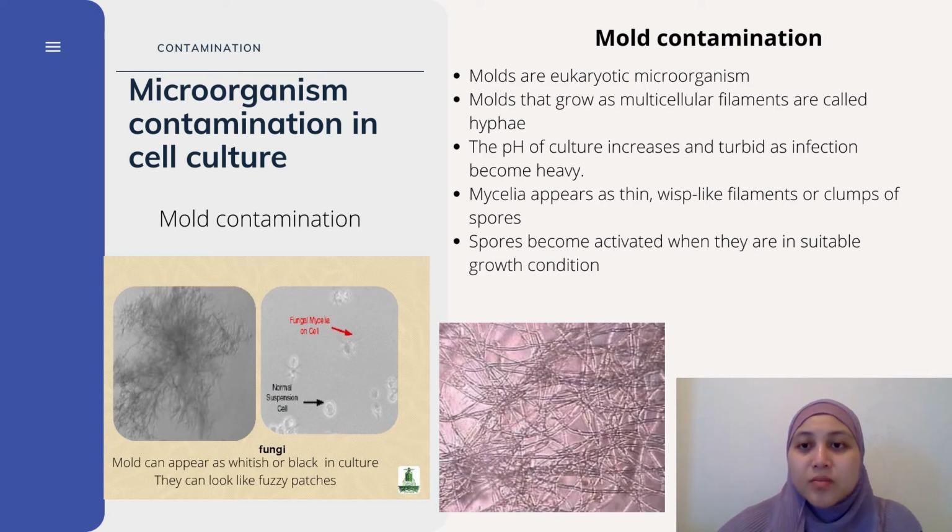Next, I would like to discuss mold contamination. Molds are eukaryotic microorganisms. Molds that grow as multicellular filaments are called hyphae. When contamination occurs, the pH of the culture media increases and becomes turbid. The mycelia appear as thin wisp-like filaments or clumps of spores. The spores become activated when they are in suitable growth conditions. Mold can appear as whitish or black in culture.